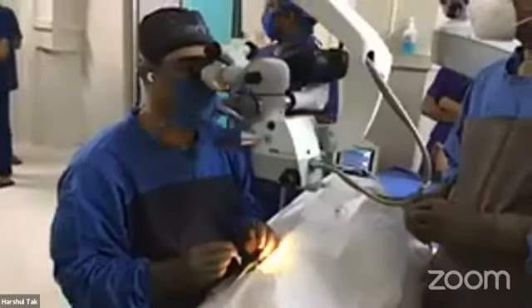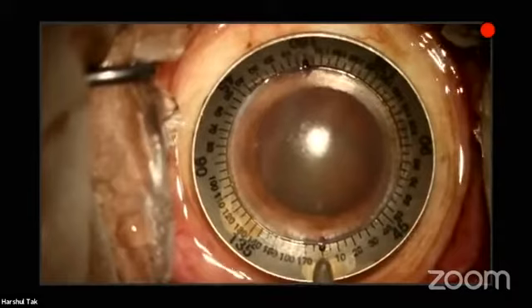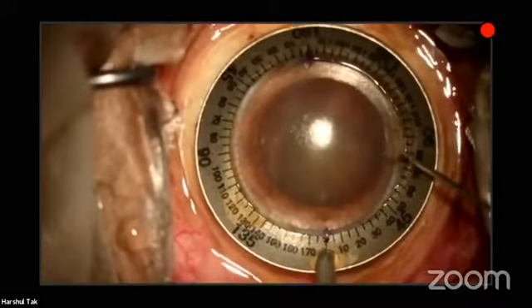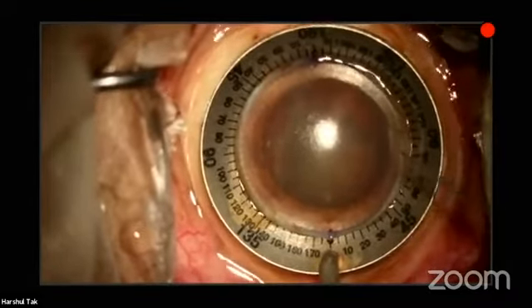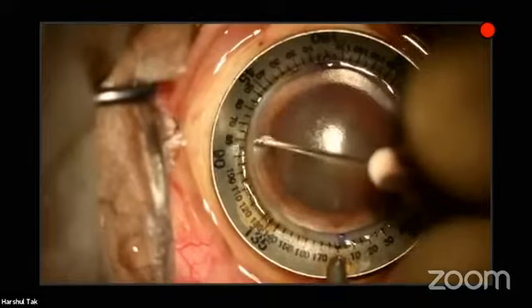So this patient required one diopter of the cylinder at the IOL plane and 0.75 diopter correction at the corneal plane. And the cross cylinder result shows that we require to put this IOL at the 79 degree, which has been calculated. So I go ahead and put 79 degree with this 26 gauge needle.